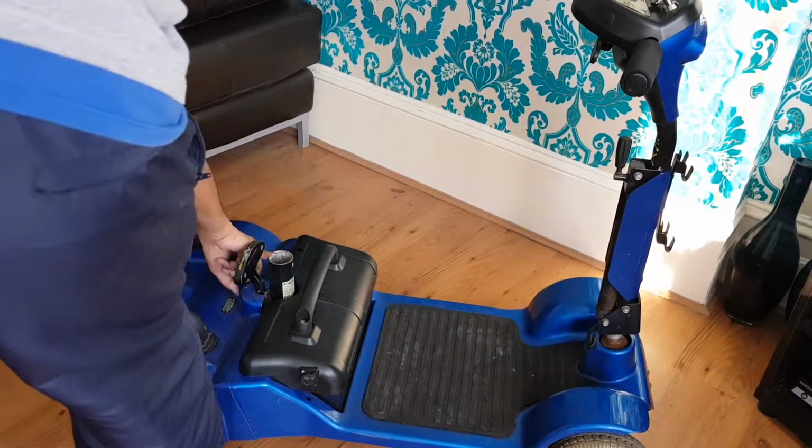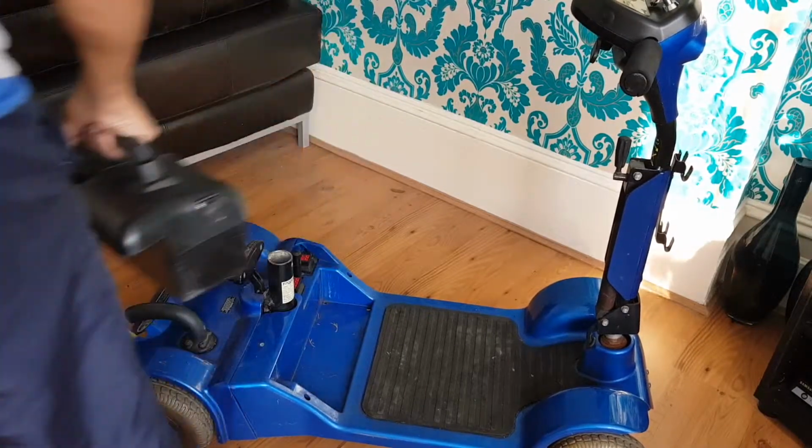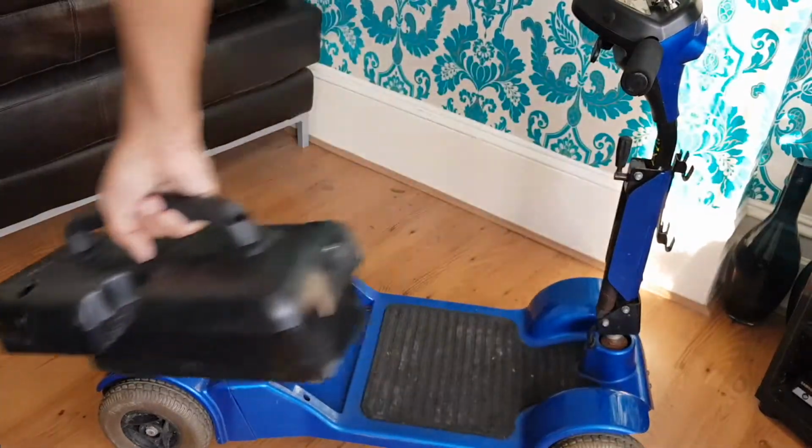There's normally a screw in here holding the battery in. You take that out, just pop the battery out. So that's the battery.